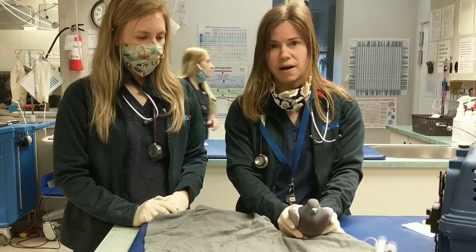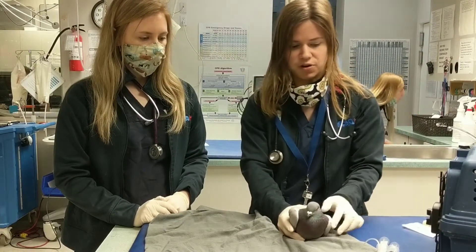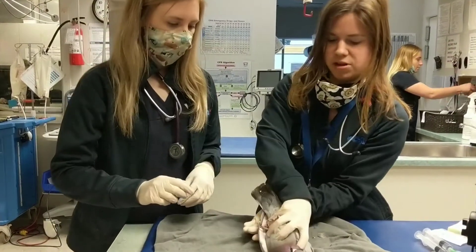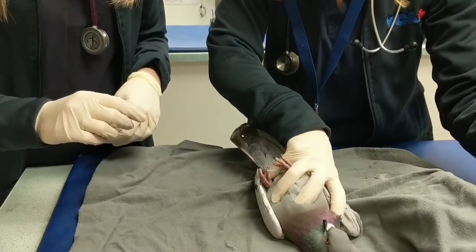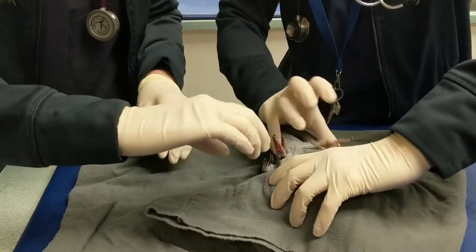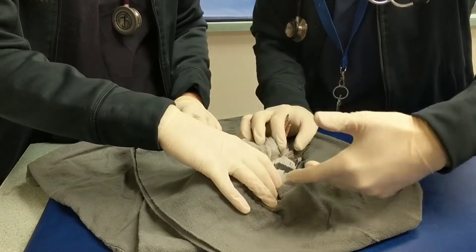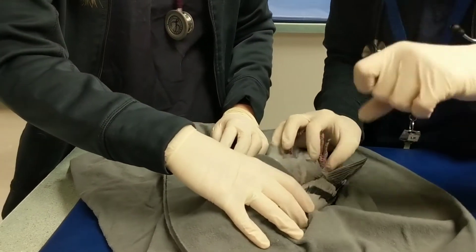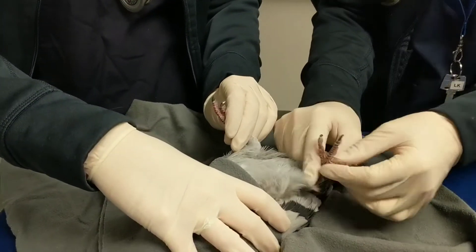And we're going to do it in the inguinal fold of the leg. So Jess is going to restrain the bird now. Pigeons do better on their back — they can actually go into a torpor on their back, so they can be a bit more relaxed. Just cover his head, and then Jess is going to hold the upper body. Never restrain the bird too tightly on the chest — they don't have a diaphragm, and so you could smother them.